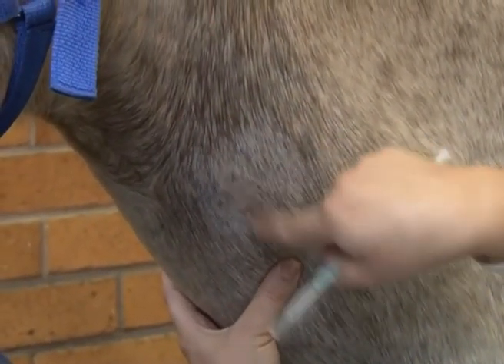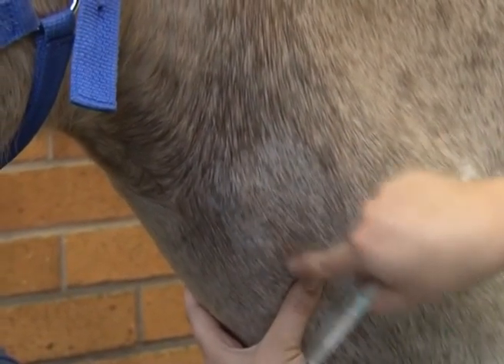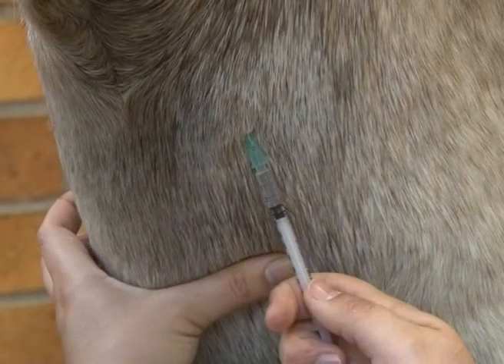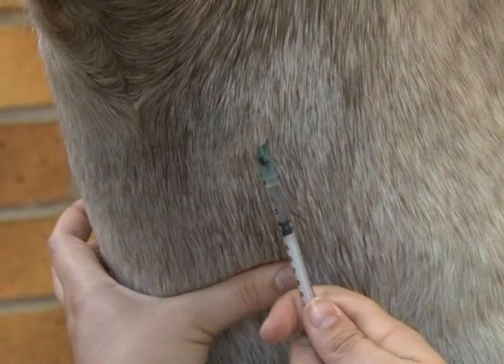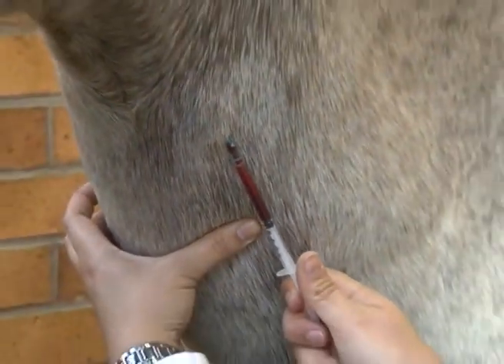The vein should be raised below the site of the venipuncture with the non-dominant hand. The needle should be firmly pushed through the skin and into the vein at approximately a 30 degree angle. Whilst keeping the vein raised, the needle may be inserted already connected to the syringe.